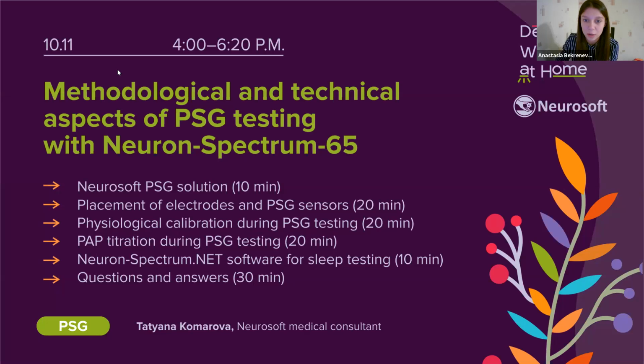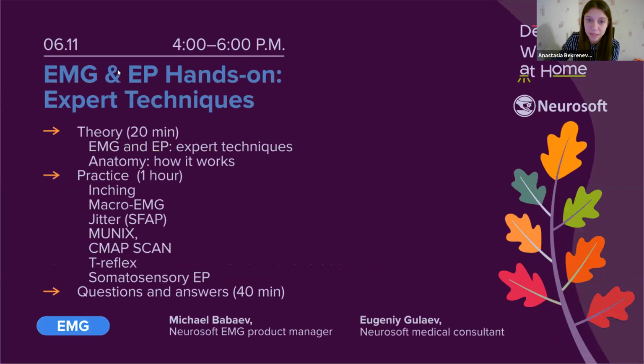So let's go back to our today's webinar. It is EMG and EP hands-on expert techniques. And our speakers today will be Mikhail Babayev, Neurosoft EMG Product Manager, and Evgeny Gulayev, Neurosoft Medical Consultant. So let's start. And Mikhail, please start your presentation. Thank you, Anastasia.